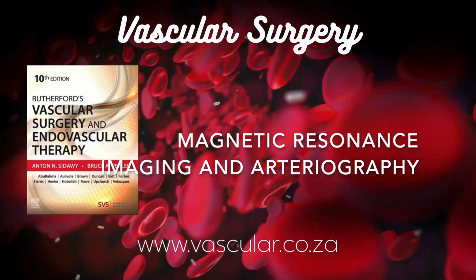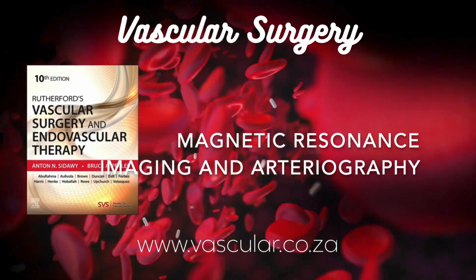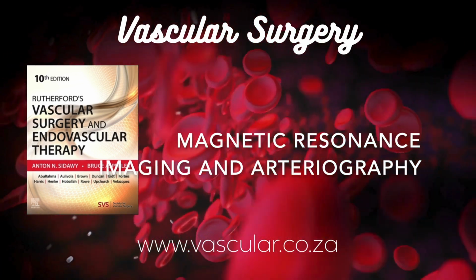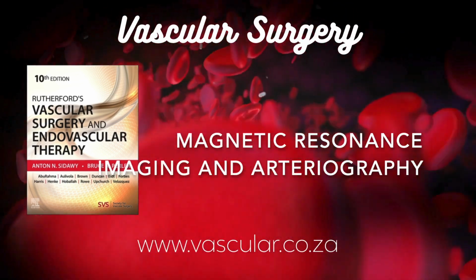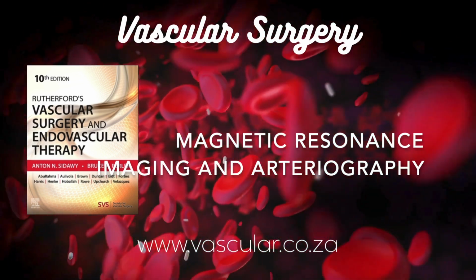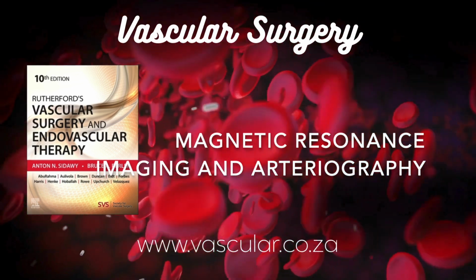And then there's continuous moving table MRA. How is that different? Continuous moving table MRA is more like how a helical CT scanner works. The patient table moves smoothly and continuously through the scanner while the MRI data is being acquired. No stopping. Right. This can help minimize motion artifacts, and it also allows for a technique called bolus chasing. Bolus chasing. Sounds like you're following the contrast.